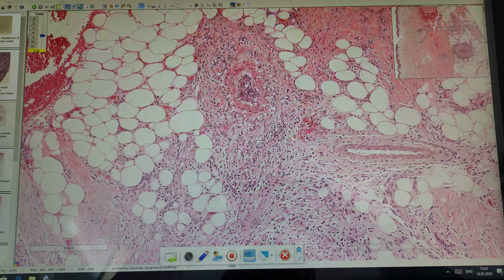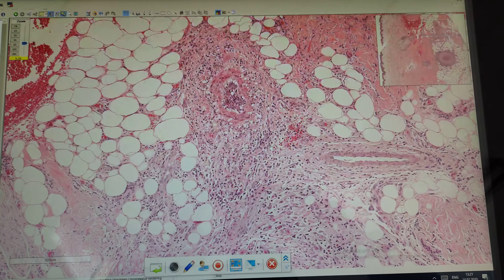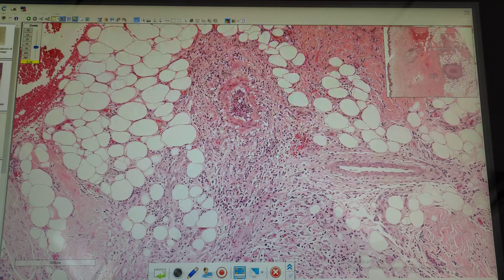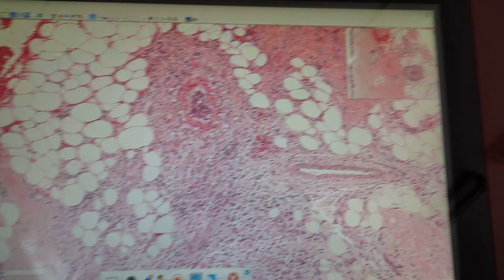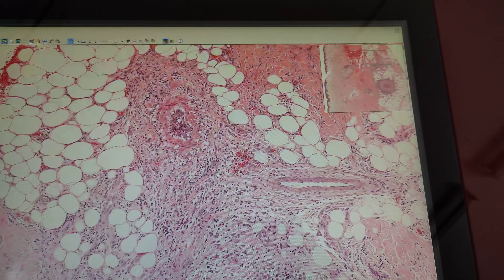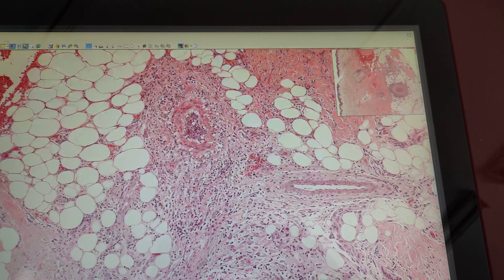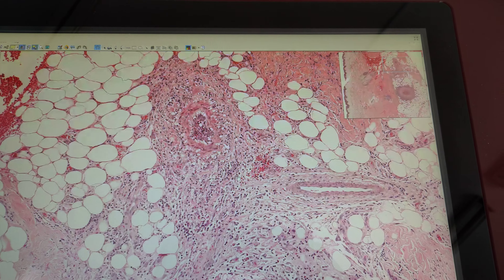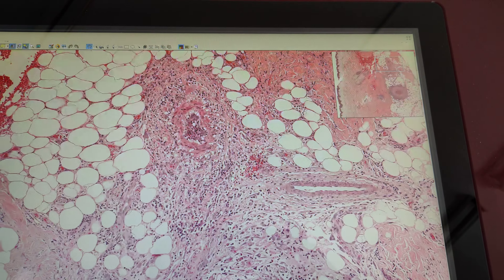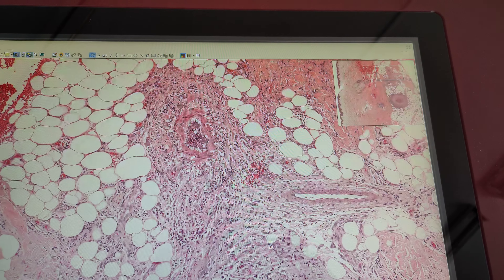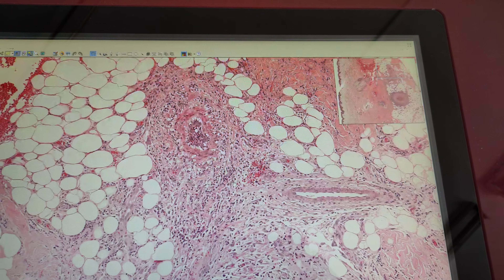Once more: this is a non-specific granuloma. Aschoff cells will be present in rheumatic fever, but this is nodular peri-arteritis — a different disease. So there are no Aschoff cells in this disease.